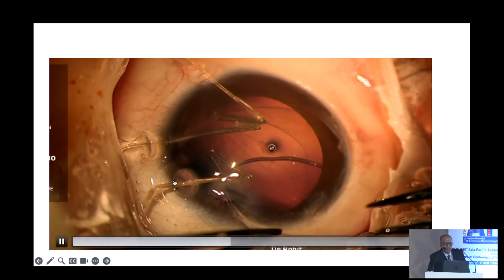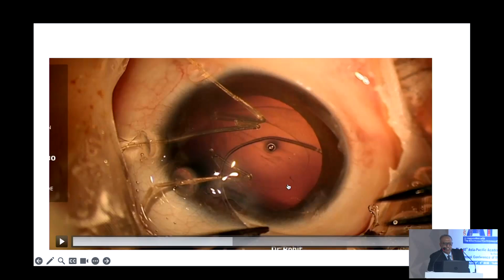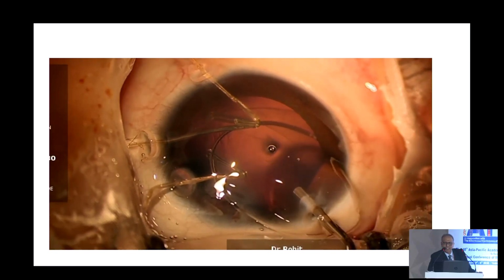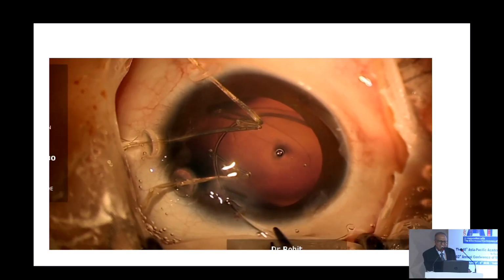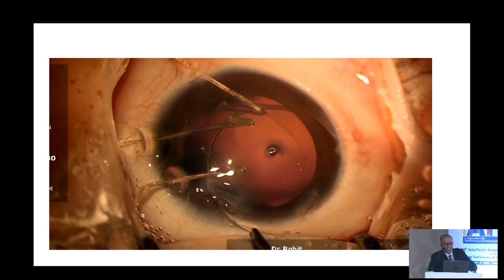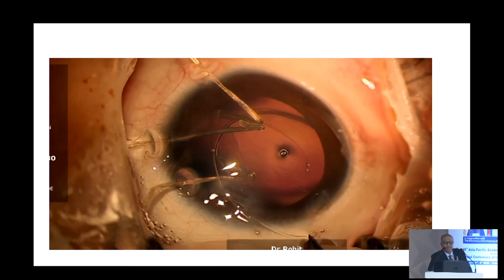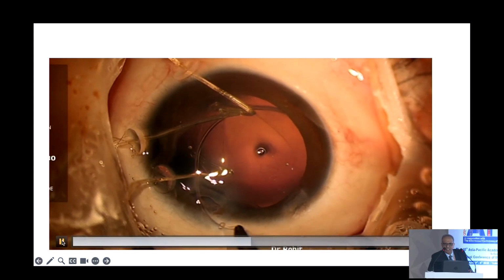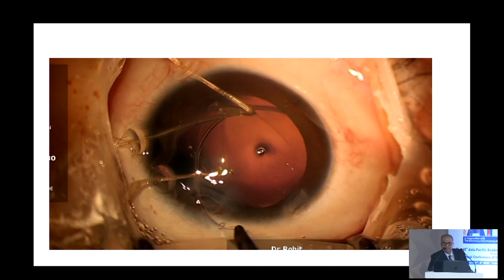I would have preferred that this CTR should have gone like this. So it is going in like this. Dr. Chi, is it okay if I continue like this? Yeah, no issue. But in your hands, yes; for novice surgeons, you should ideally do it the other way around. And how do you see that the capsular hooks don't come in the way in such a situation? I think it's a different plane that you're inserting it, so it really doesn't get engaged. It doesn't make a difference.